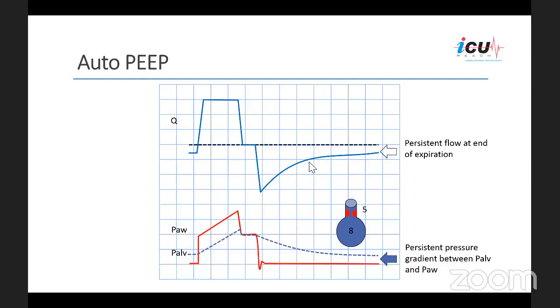Lovely, thank you. Another question: if there is no role of increasing pressure support in obstructive airway disease with Auto-PEEP, why do we keep it 0?